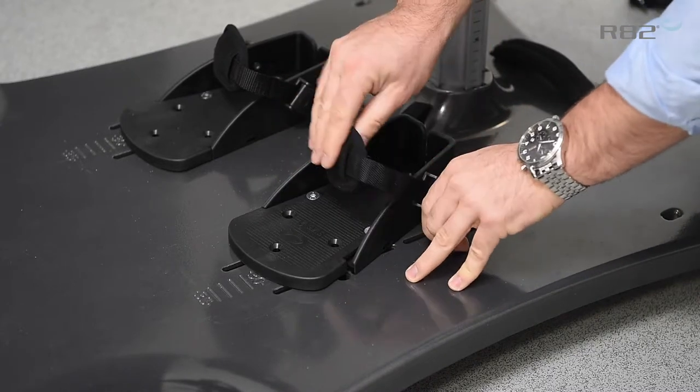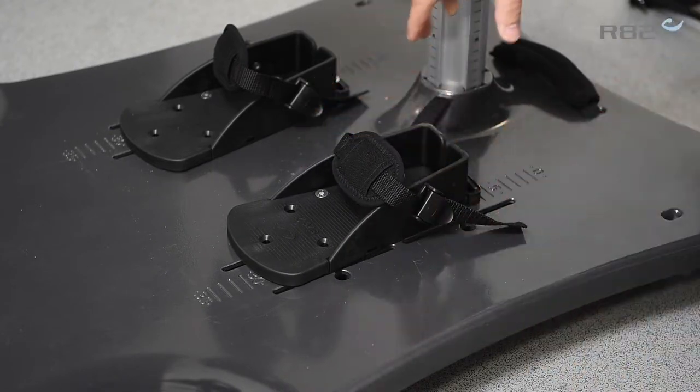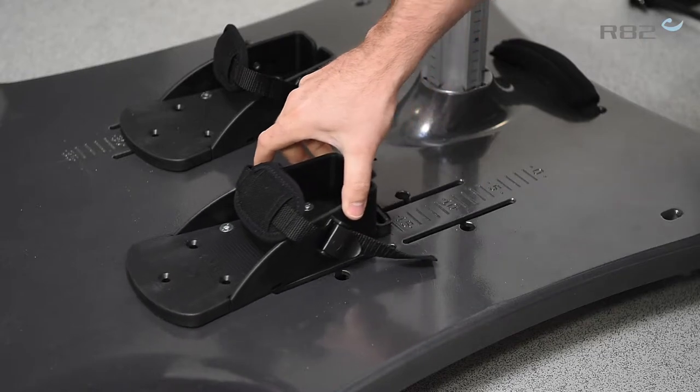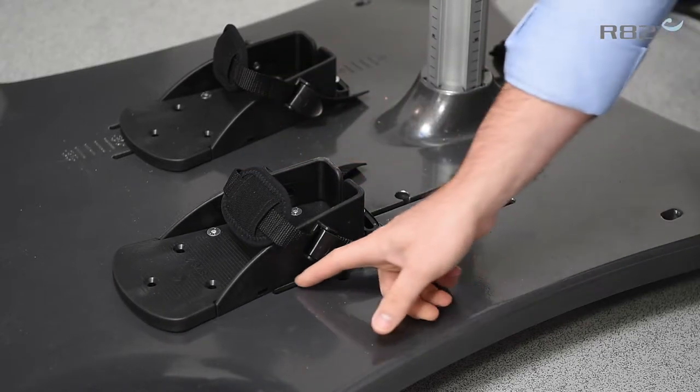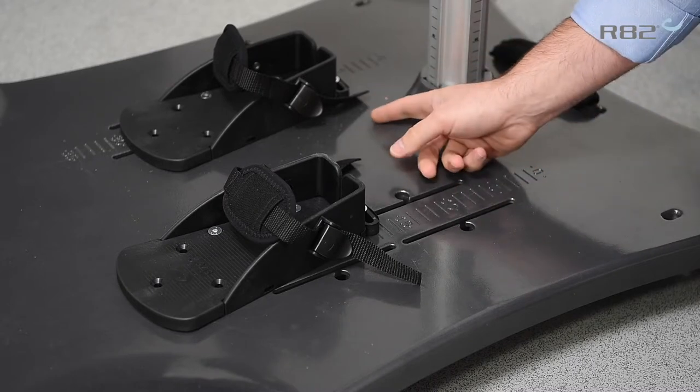There is a snap lock there for the positioning aid. The other neat thing with the foot positioning is you can move it forward and backwards, with clear markers of where you want to be so you have a symmetrical position from both sides.